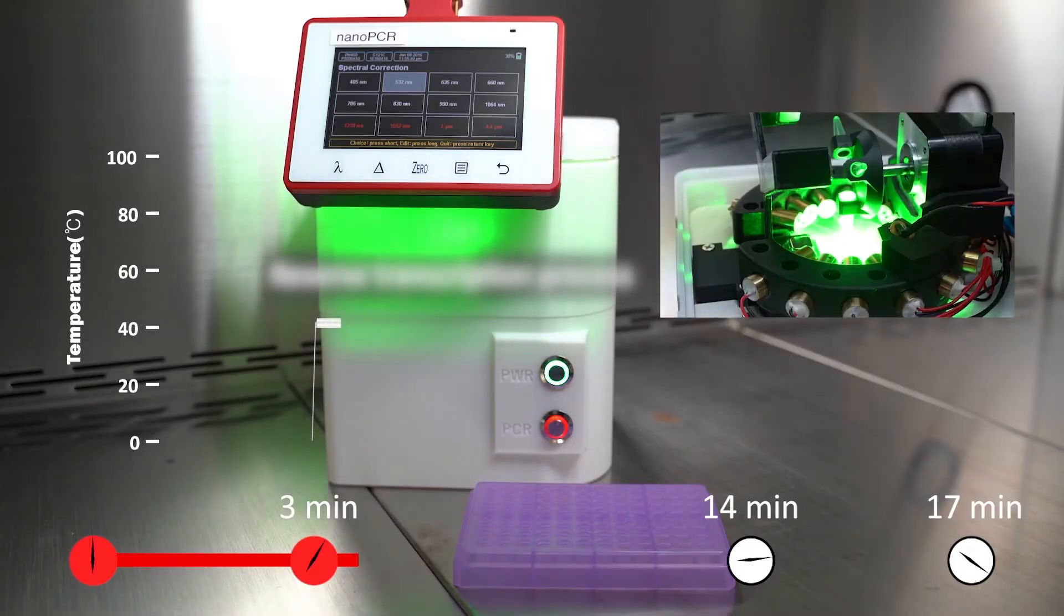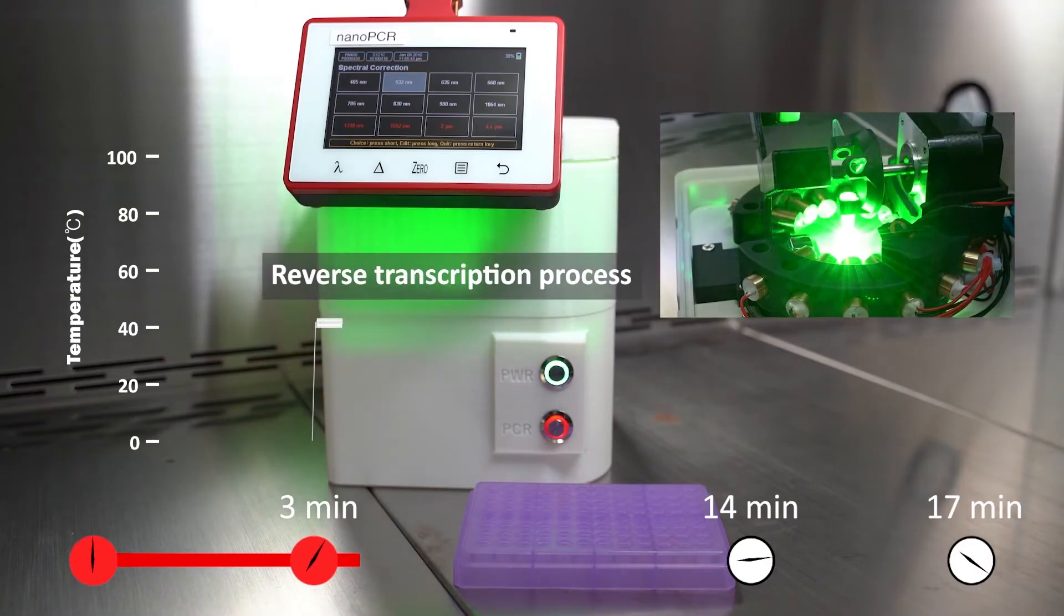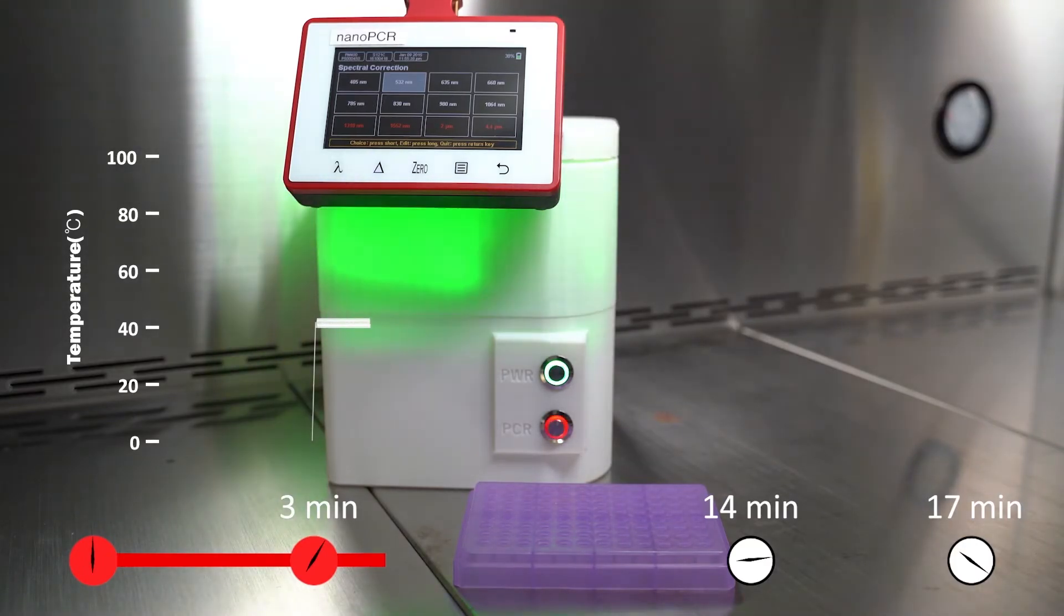In nano-PCR, each cycle takes only 9 seconds in comparison to conventional RT-PCR, which takes around 2 to 3 minutes. This means that 40 PCR cycles take only 6 minutes in nano-PCR and up to 2 hours in conventional RT-PCR.